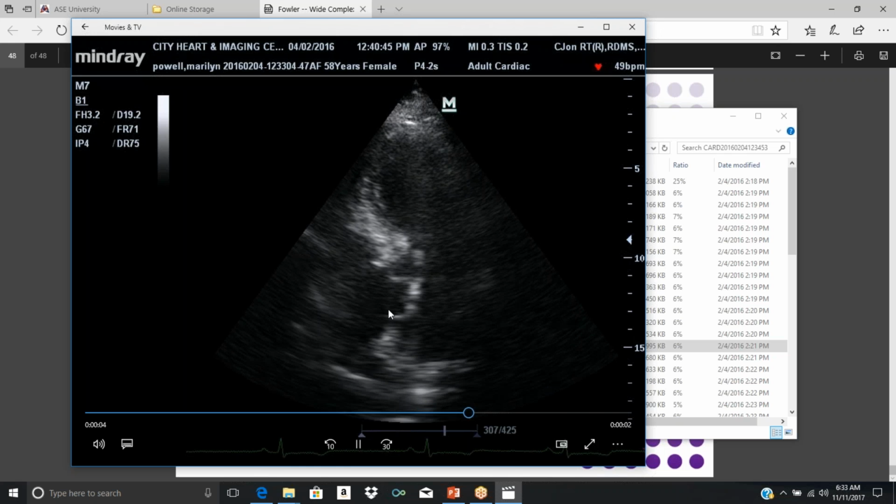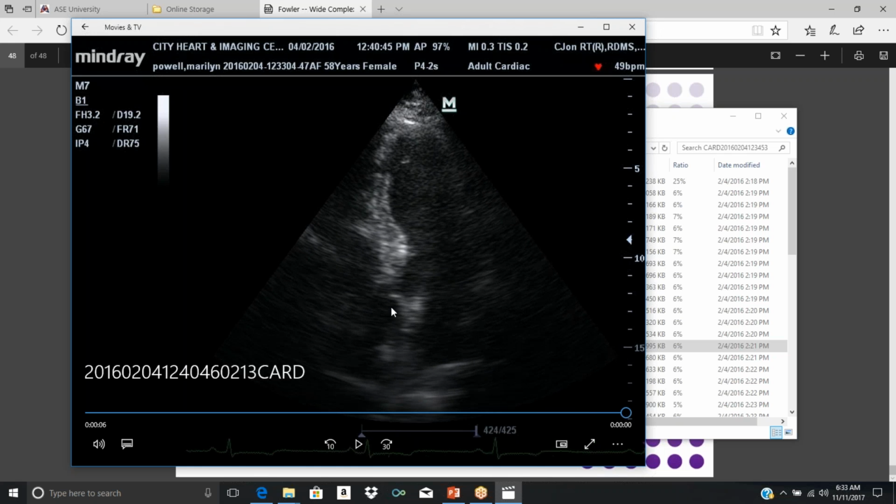Okay, so this is your 5-chamber view, because you can see the aortic valve, the aortic root, and the ascending aorta. And in this view, you see the moderator band in the right ventricle. So from the apical 4-chamber view, if you tilt your transducer downwards, so remember these are finesse movements. It's not any abrupt and large movement. Very gentle.